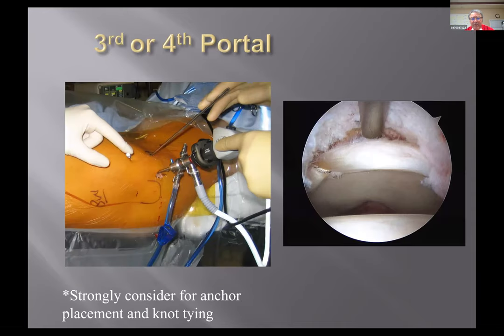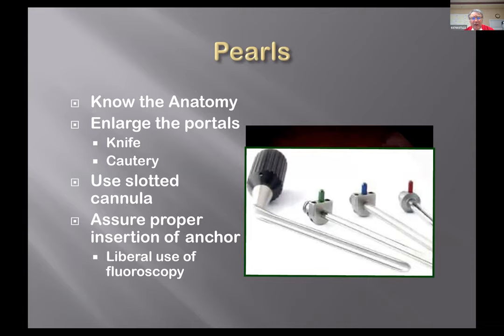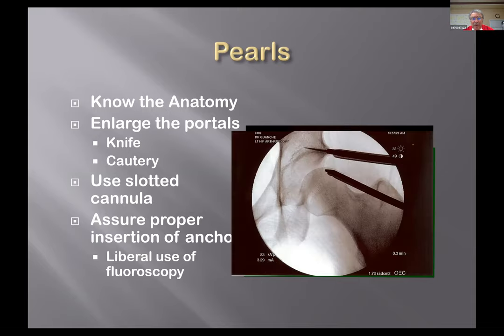The way to put in anchors is to get the correct angle, get your anchors in so they're not going into the acetabulum. You want to have a view of the acetabulum so that you know you're not going to drill into it and that you have the proper angle to put in your instruments. Again, use your portals, use the correct one to give you the right angles, use the larger instrumentation. You can use your x-ray, where this is a Carlos Guanche x-ray of a hip labrum repair. And you can see that that anchor is not going to go into the acetabulum on this view.